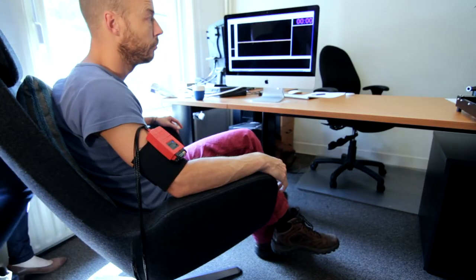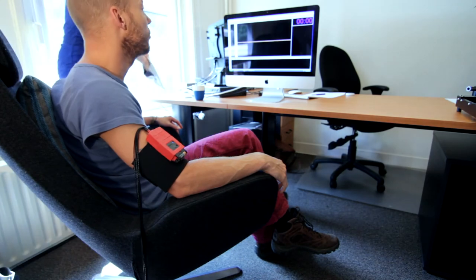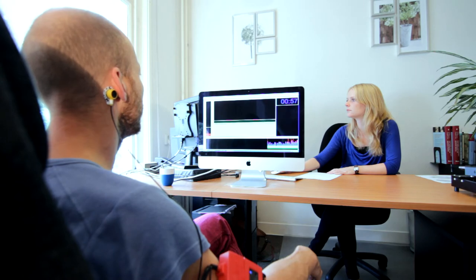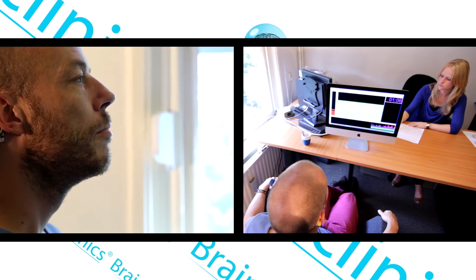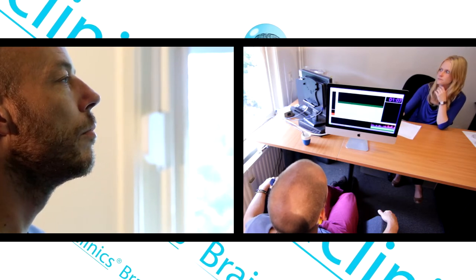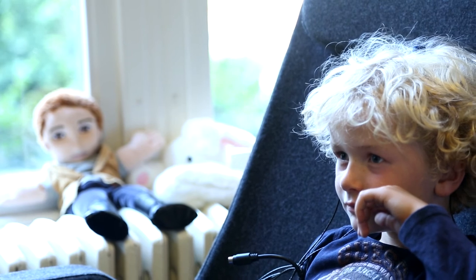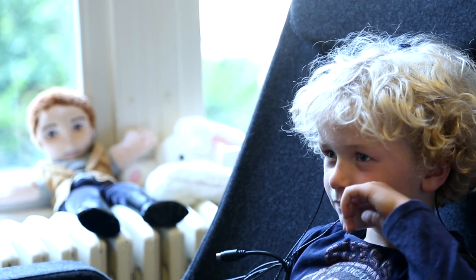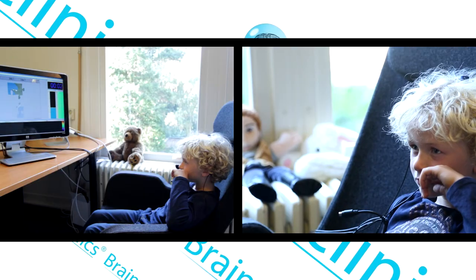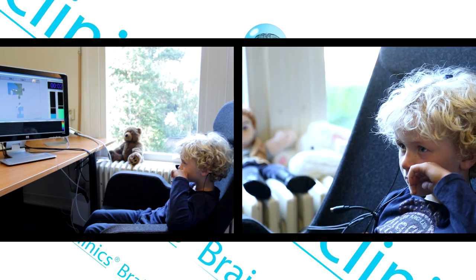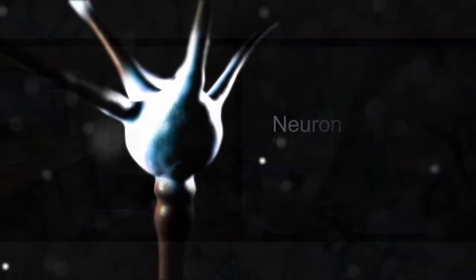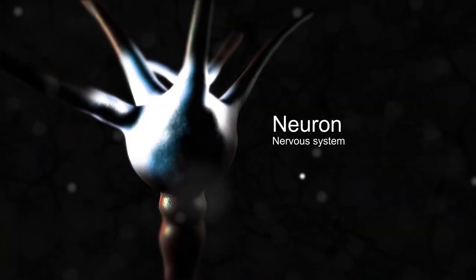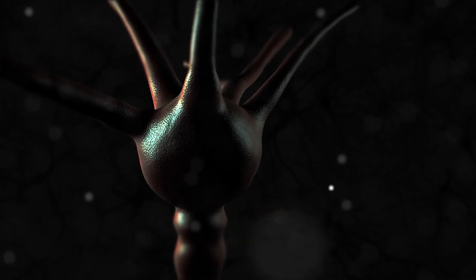During the neurofeedback treatment, the client sits in front of a monitor. The therapist places electrodes on the client's head, which measure brain activity. Clients receive visual and auditory feedback based on their own brain activity, and are rewarded with this feedback when the right brain network activates. By visualizing brain activity in real time, the client trains to activate the right brain activity by switching on and off a specific network in the brain.